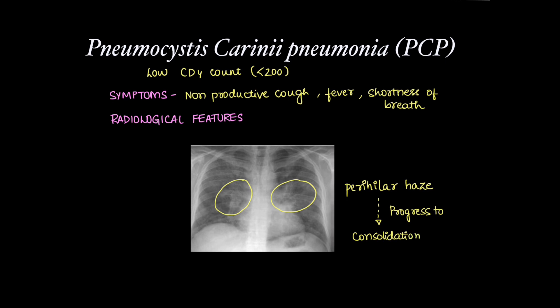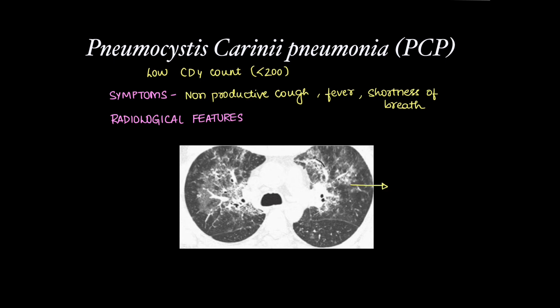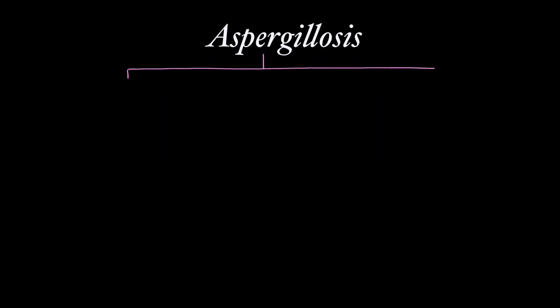These findings can also be seen on CT imaging as perihilar ground glass opacities or consolidation with associated interstitial thickening. There can be subpleural sparing, and pneumatoceles can occur leading to spontaneous pneumothorax.